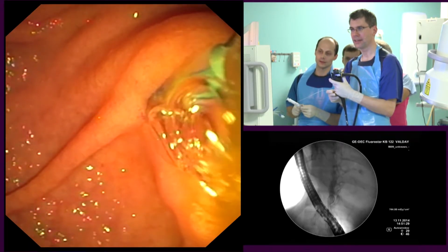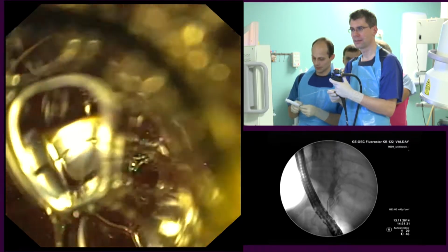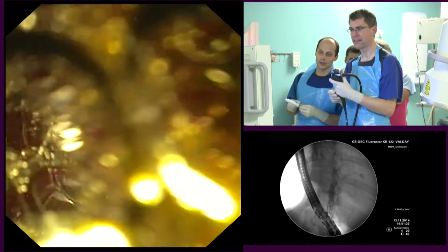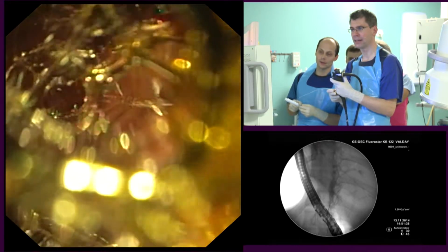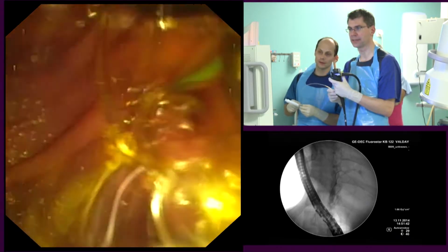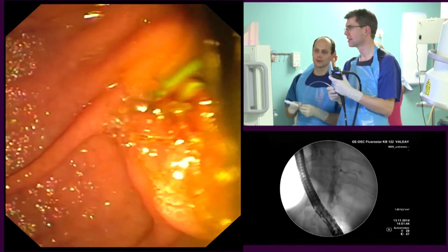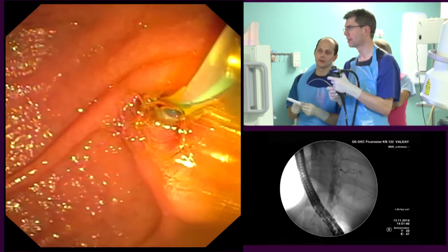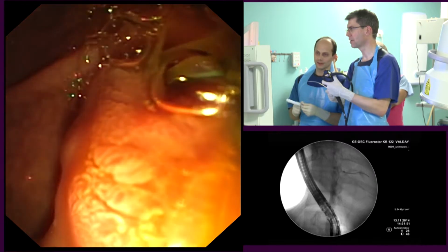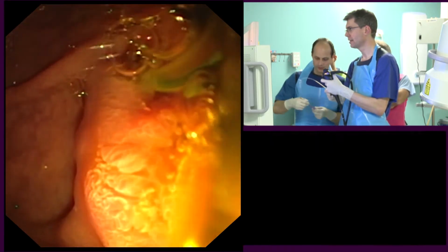Pull, pull, pull. And now, pull, pull, pull. Just a moment. Again. I think you have to come down all the way, right? And now try to advance. Yeah, that's much better. There we are. Good, welcome back. Now, why not exchange, okay? Let's try. Just a moment.